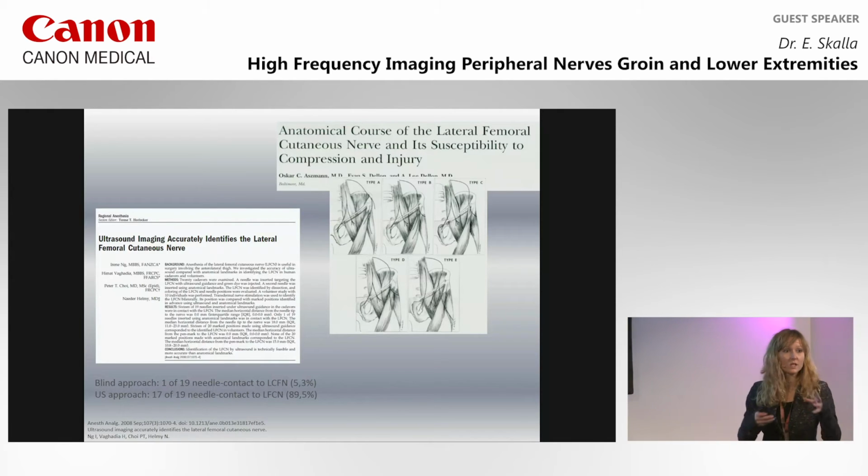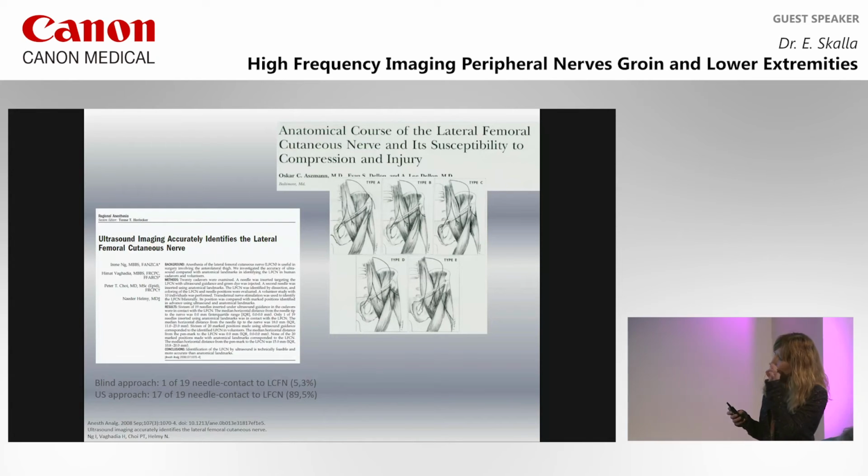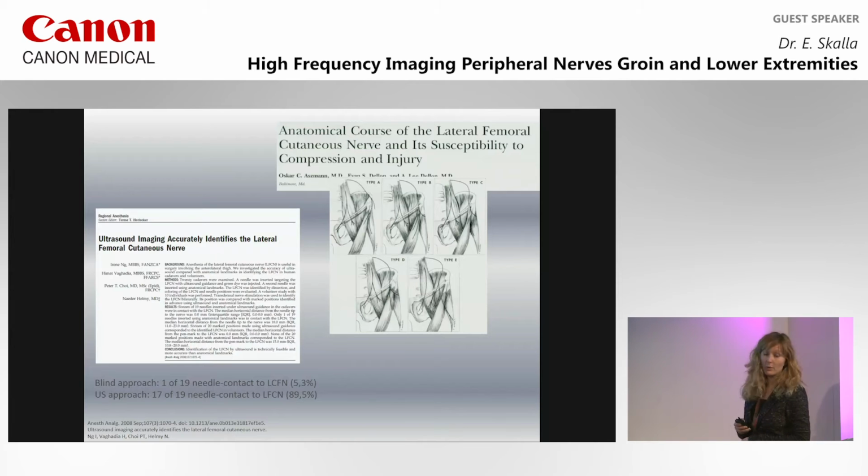Of course, you could use a high amount of drugs, and then you will cover the whole region. But when you want to have fewer side effects, you take a smaller amount of drugs, and with the ultrasound you will be precise and very quick.